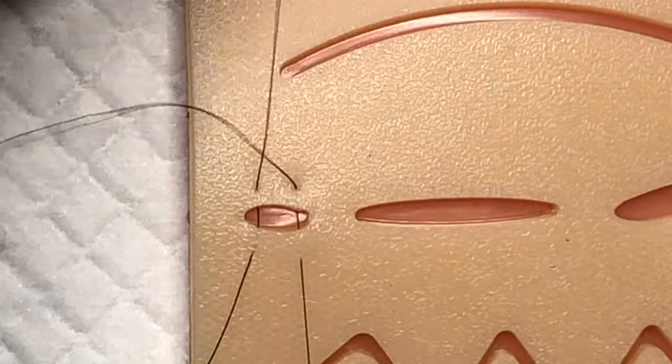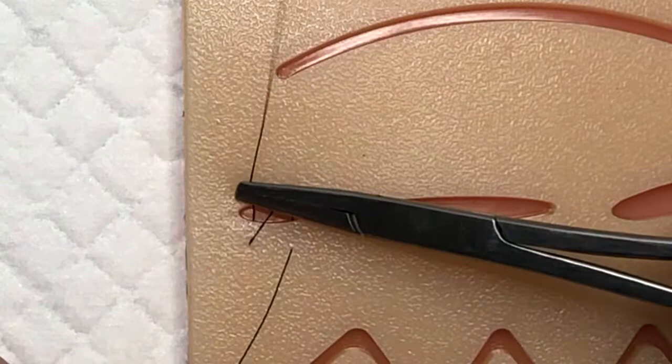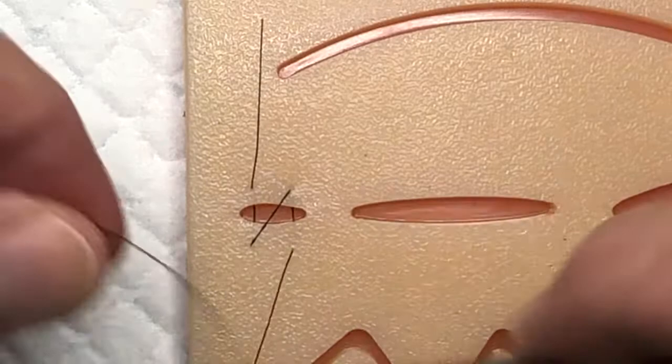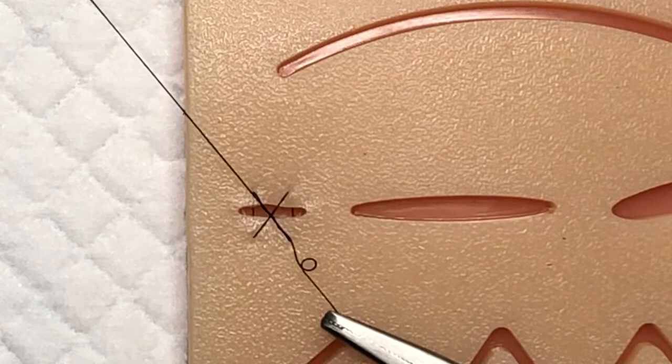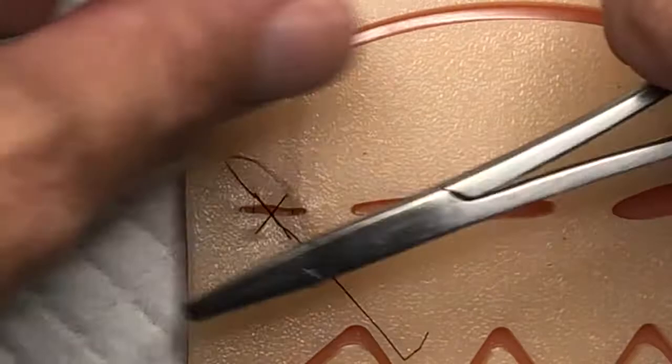What you're going to see here is coming across, going diagonal, coming across — and then we're going to tie. We do our instrument tie. See how that squares up? We've basically got an X, so it's your figure of eight. We're going to put a little bit of tension on that.